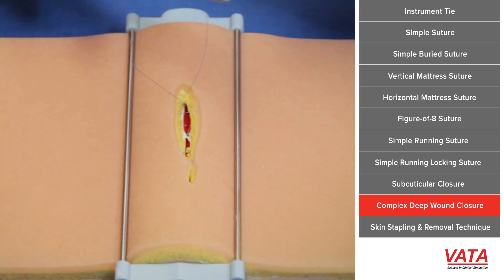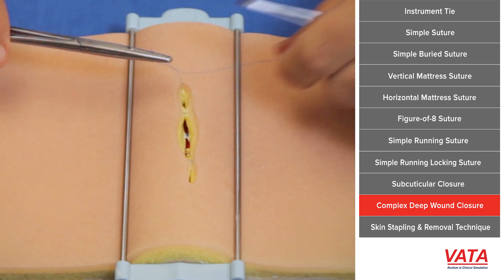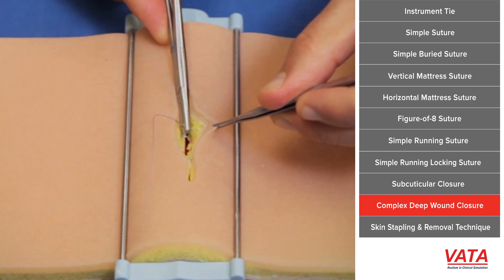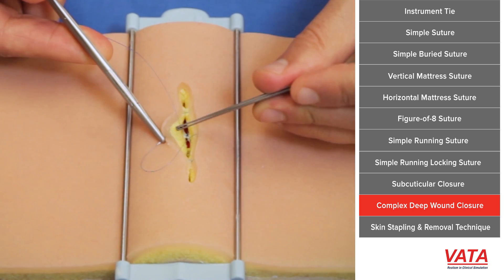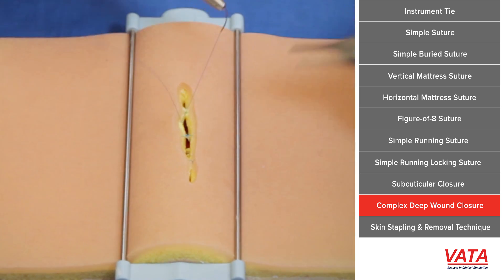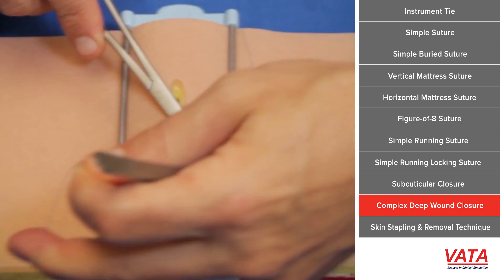Another word of advice: notice how I'm going to the ends first. The ends have the least amount of tension — the middle of the wound gapes open the most. Most people want to close the middle first, but if you sneak up on it and start closing the ends first, you'll take the tension off. By the time you get to that middle stitch, it'll have the least amount of tension on it. So here we have two stitches and I'm going to put one more. Notice I'm grabbing deep dermis, starting deep, coming superficial, and grabbing right above the dermis on the other side, coming out the same distance.